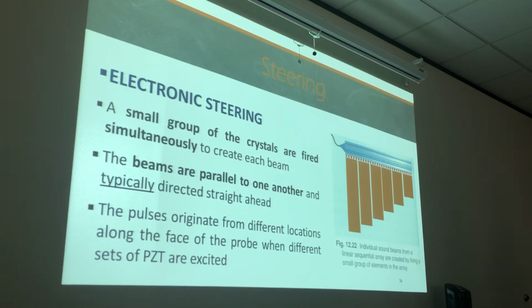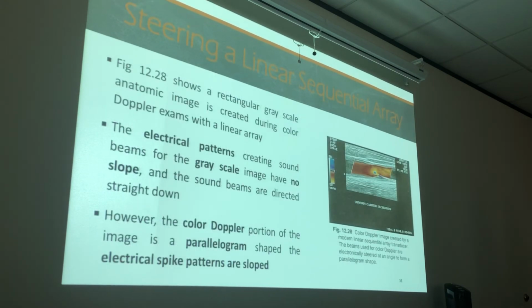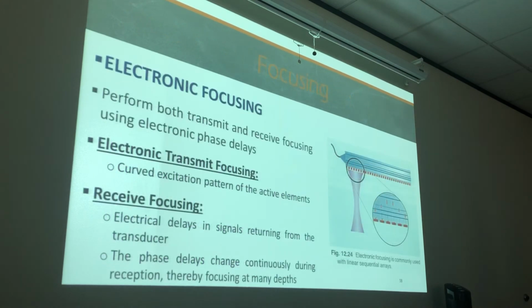Okay. Guys, we need to recover that steering and focus. Yeah. We'll cover it when I finish getting through this. Okay, so here we go, guys, right here. So here are our elements right here while we're talking about focusing, coming right to you, Pat. Electronic focusing: a linear switched array transducer is going to have both transmit focusing and dynamic receive focusing. Remember, electronic transmit focusing is done with a curved excitation pattern. Here we go, Pat, right here.